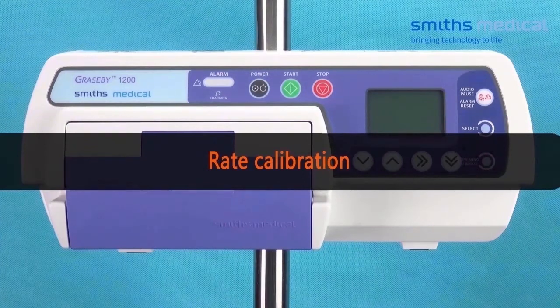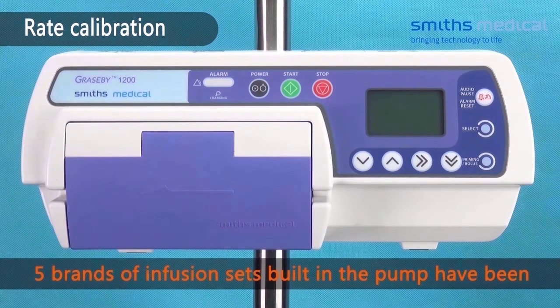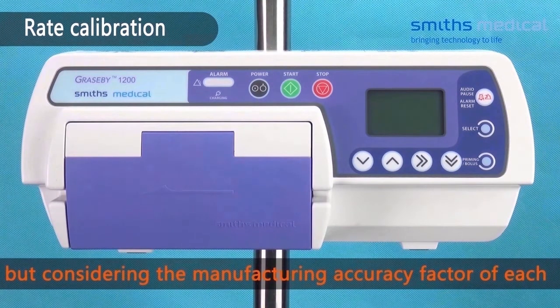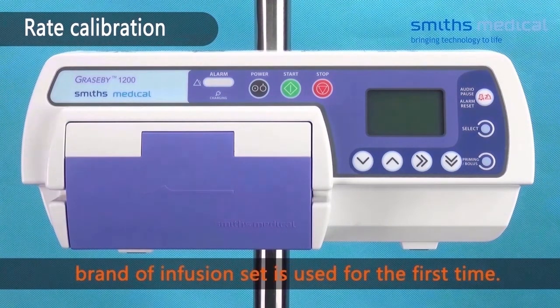Rate Calibration. Note: rate calibration is to increase infusion accuracy. The 5 brands of infusion set built into the pump have been calibrated when delivered. However, considering the manufacturing tolerance effect of each brand of infusion set, users are suggested to perform calibration before any brand of infusion set is used for the first time.